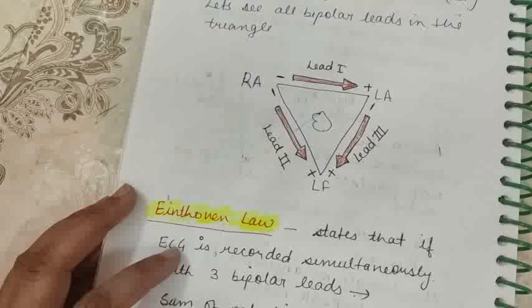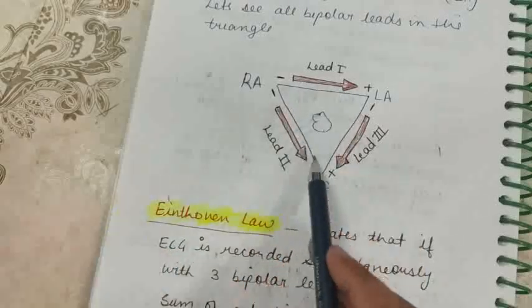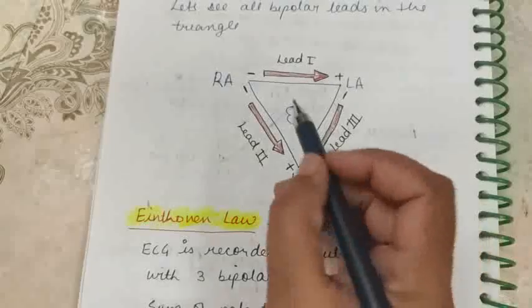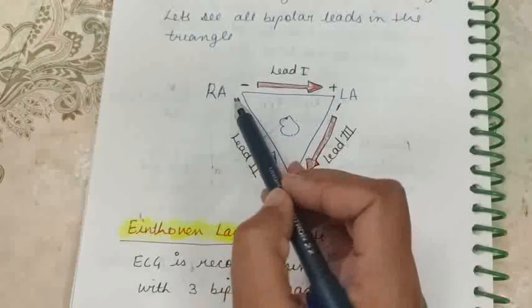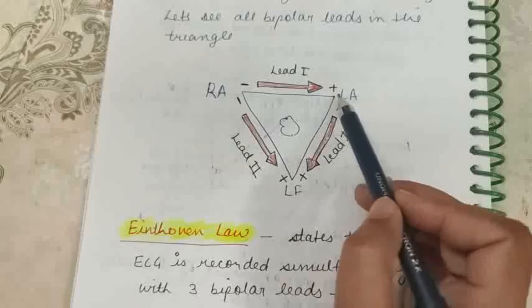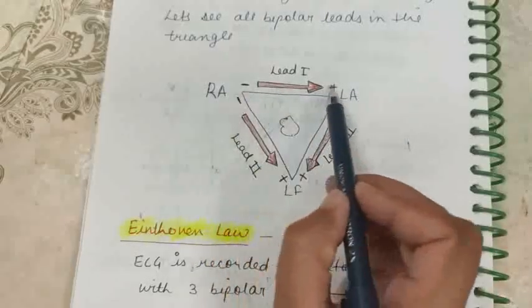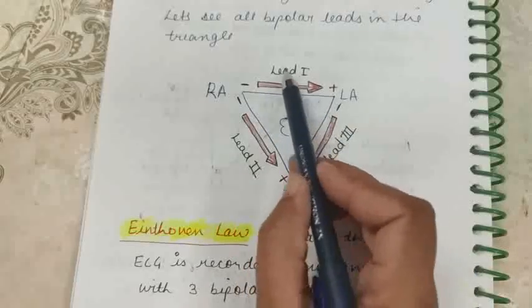Fine. So one by one we'll try to understand what these leads are and how they are derived. First of all, see lead 1, 2 and 3. If the right shoulder is taken as negative and the left arm is taken as positive, then from right arm to left arm, this lead is called lead 1.